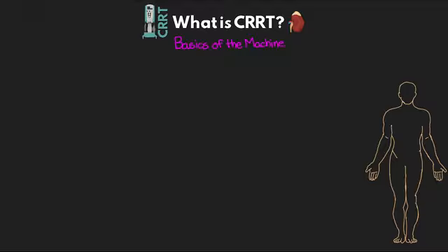Now there's really 3 main machines that are used most often. 4 if you want to count the most recent upgrade to one of them. And honestly there may be others, but these are the 3 that I've seen. Now, the first and most popular of these is going to be by a company called Baxter, and this is the more common and older machine, which is the Prismaflex, as well as their new Prismax.